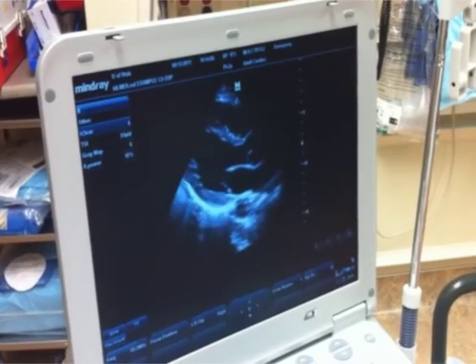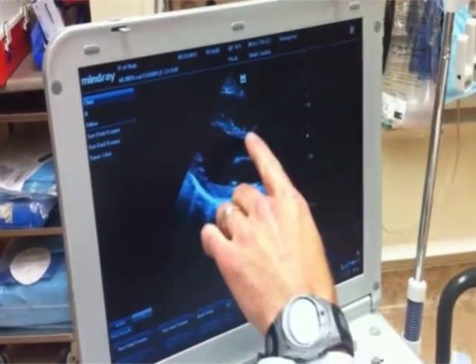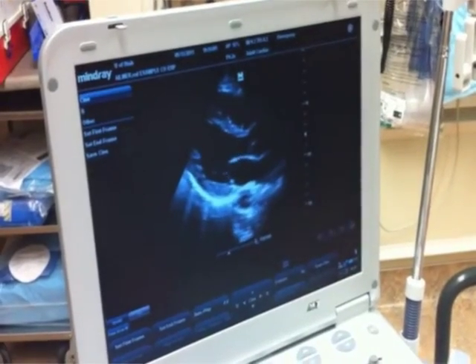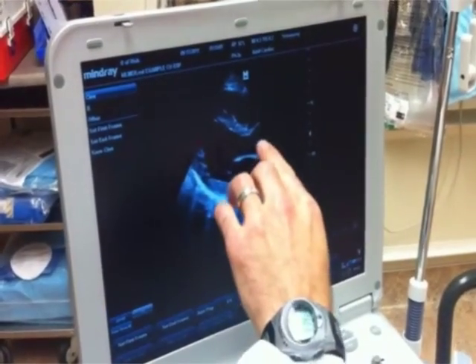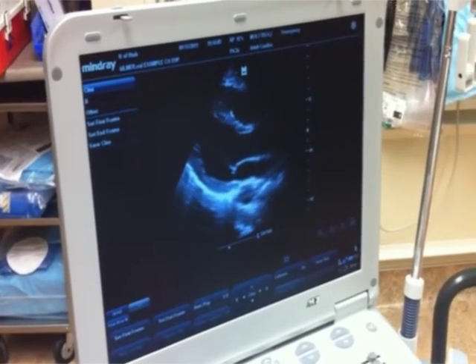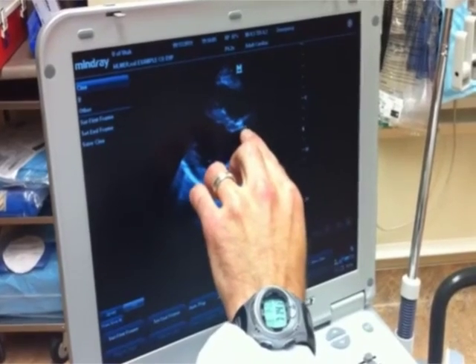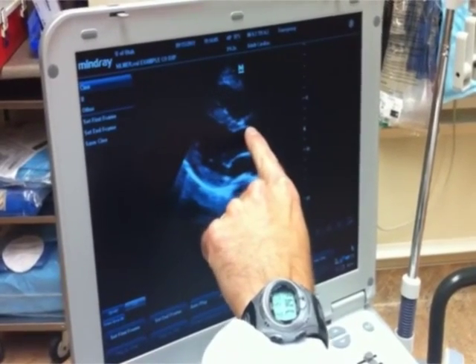I'm going to go ahead and freeze this window. What I want to do is find that point when the two aortic valve leaflets are completely open. Here you can see they're closed by that white line right there. Here we go into systole. As we go into systole, we can see that the two leaflets are open, and you can see the leaflet right there, that little dash of white.